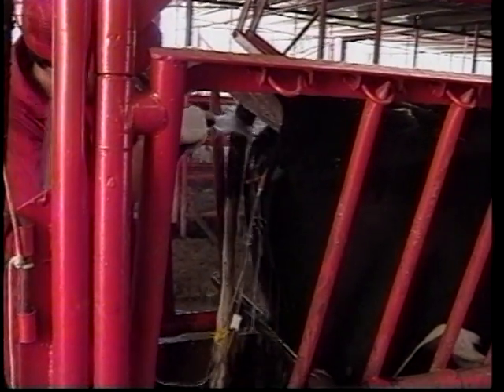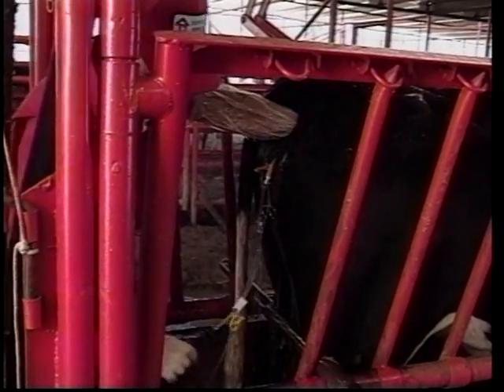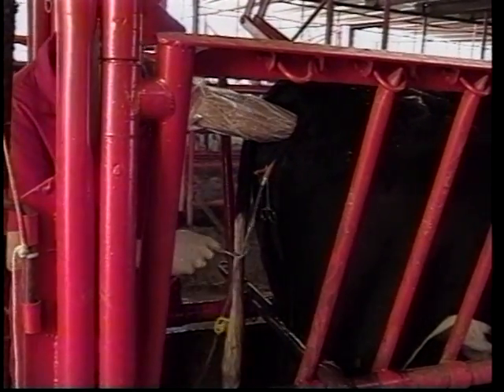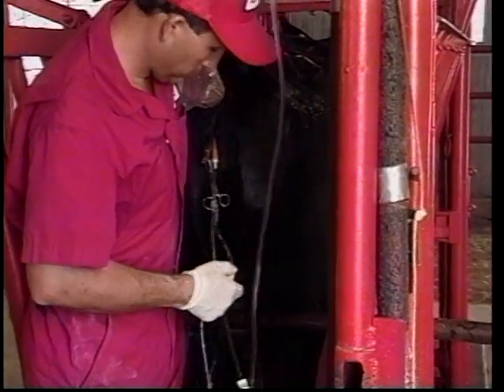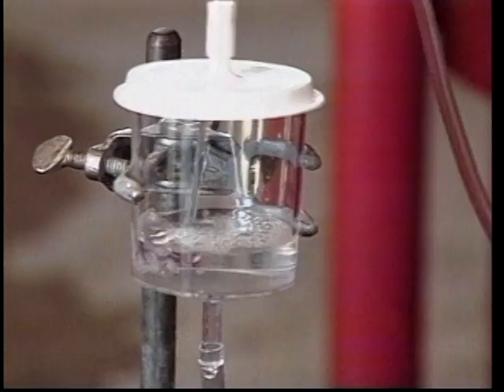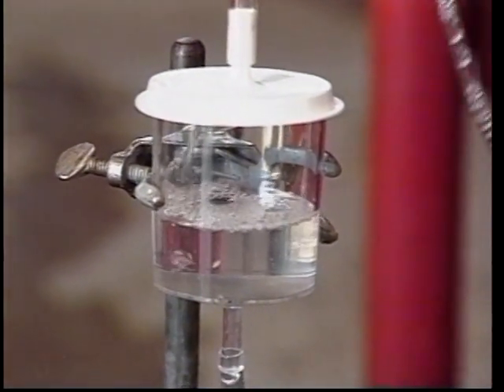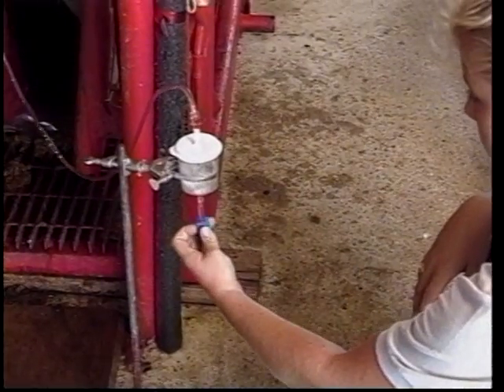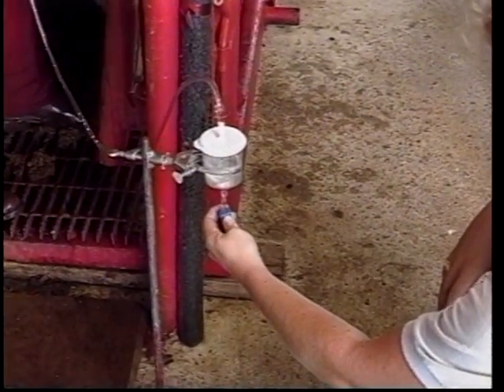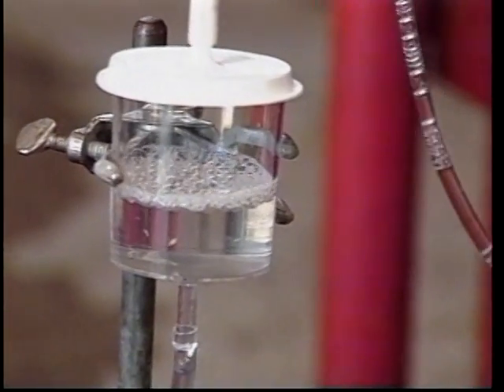At this point, the inlet is open and the fluid is flowing into the right uterine horn. Now we will clamp off the inflow and open the outflow. The fluid will then travel down the outflow tube and enter the embryo filter. As the fluid begins to fill the embryo filter, the technician can open the clamp on the bottom of the filter and allow it to drain off.